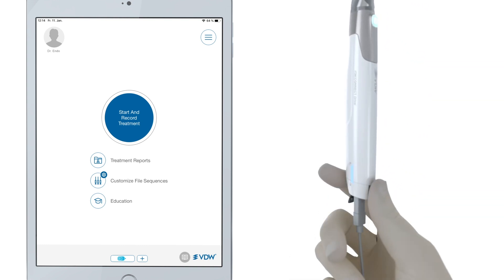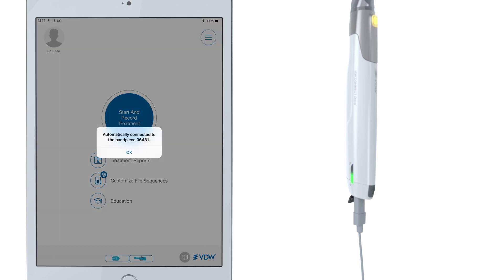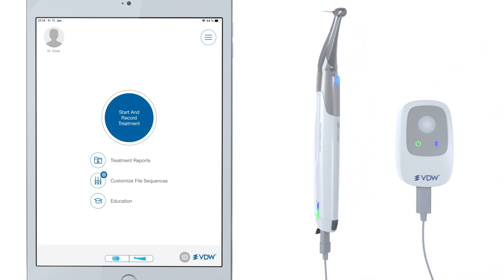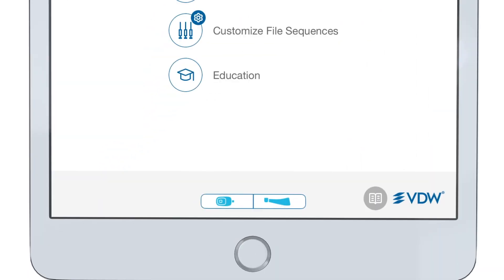Now turn on your handpiece. It will automatically switch on Bluetooth and connect to the app. Once it's connected, a message pops up on the screen. Press OK. Now you have both devices combined and connected to the app. This is confirmed by two little icons that you can see at the bottom of the Connect app, which are attached to each other. If you have no cable between the two devices, the app will show two individual icons that are not attached to each other.